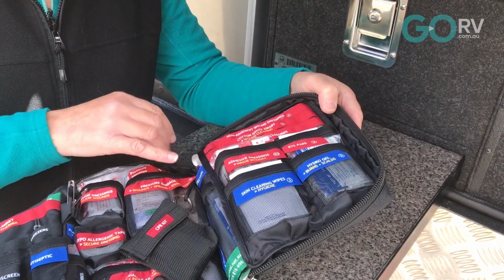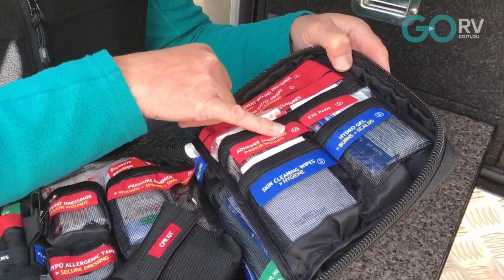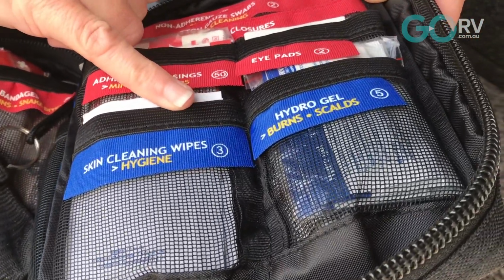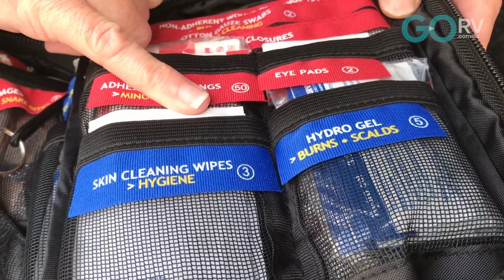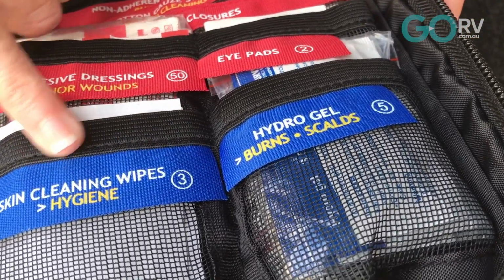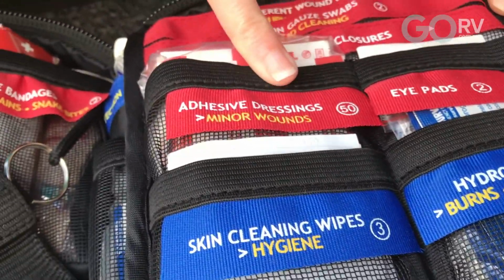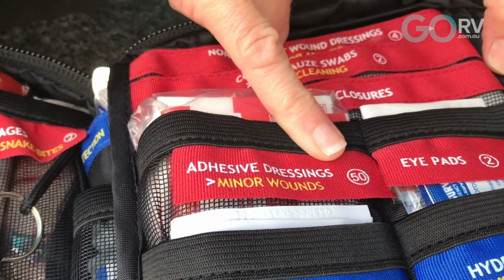But what I wanted to also point out was some of these have got numbers next to them, so be aware this is telling you how many in total there should be of any particular item. So if you're using some of the contents of your first aid kit, you know straight away that there's supposed to be 3 of this particular item or 5 of this particular item, etc. This one here is quite a lot. Okay, so we're talking band-aids and things like that, so that's around the 50 mark.